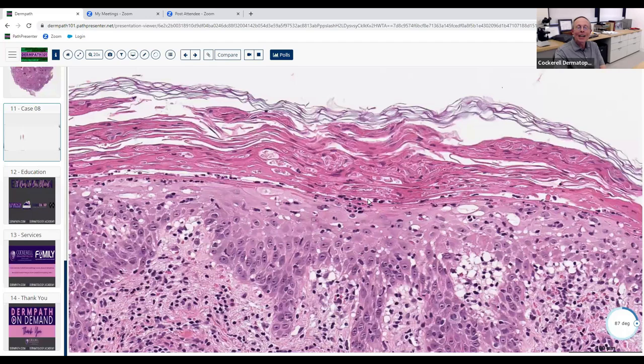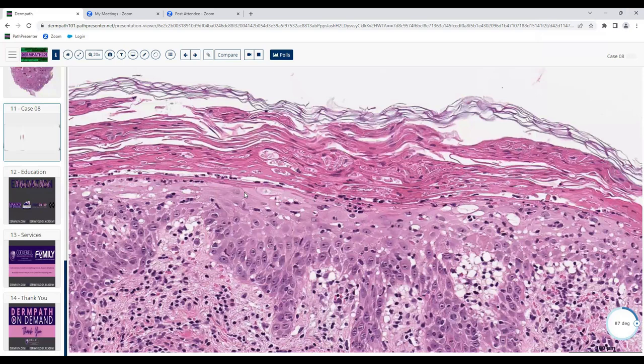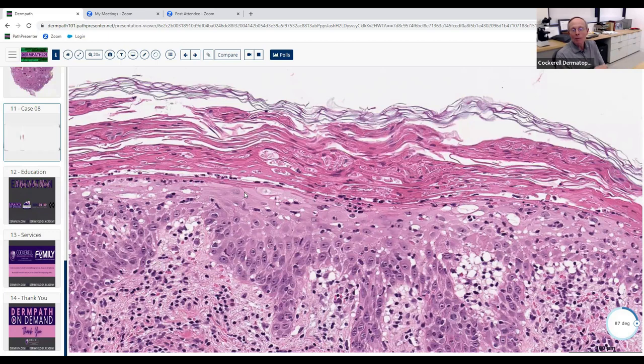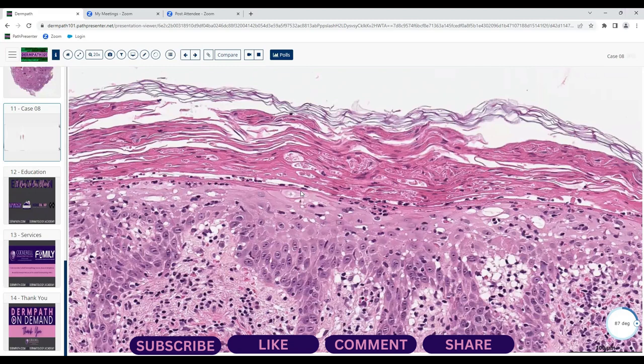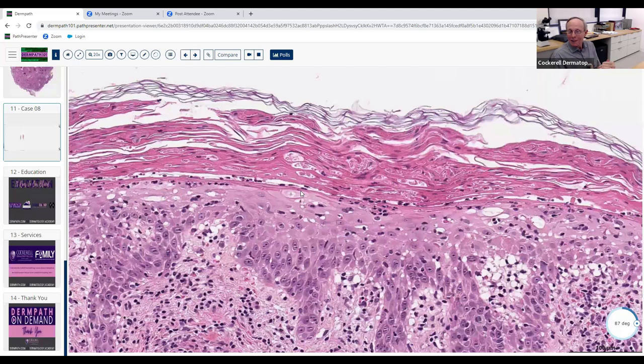Parakeratosis plus neutrophils — what do we call that combination? It's a hyphenated term — scale crust. It means there's crusting with neutrophils, serum, and the parakeratotic scales. Clinically this won't look like the micaceous scale of psoriasis — it'll look more scabby and crusty, feel different. Now looking at the papillary dermis: neutrophils up here, lymphocytes down there, extravasated erythrocytes. And in the epidermis, what are these larger eosinophilic cells? Dyskeratotic keratinocytes — exactly correct.